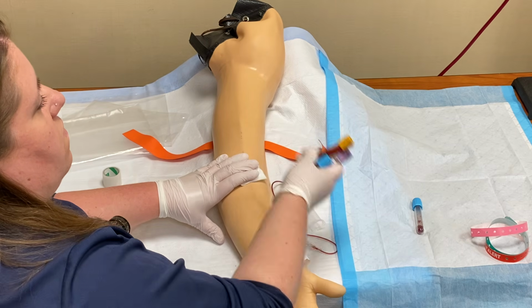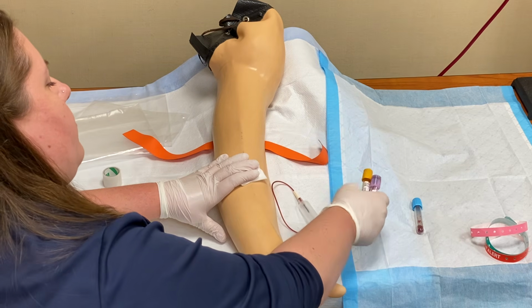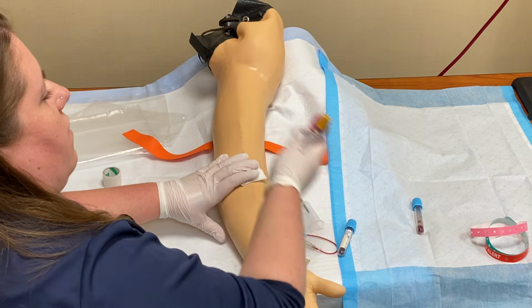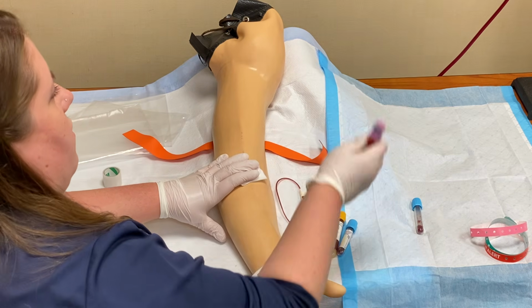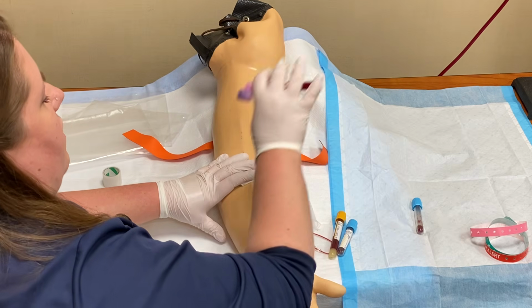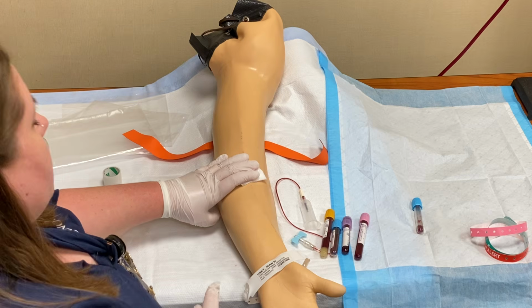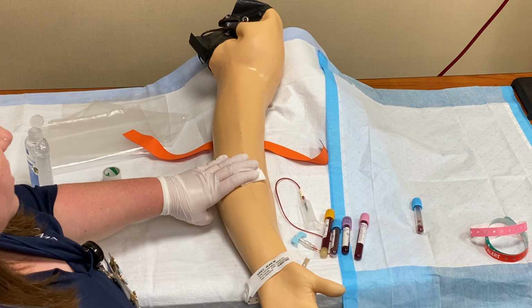1, 2, 3, 4. I'll put down my blue tube. 5, 6, 7, 8, and put down the rest of my tubes. So I'm gonna wait the time to make sure that my patient has stopped bleeding.